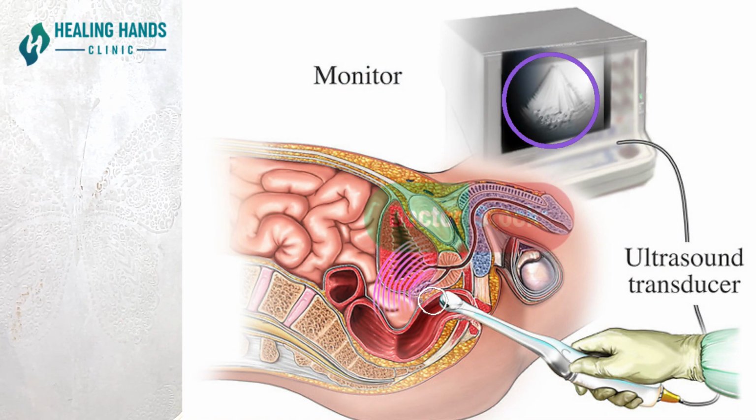This gives us an analysis or an overview of the anatomy of the perianal region, with which we can visualize the internal anal sphincter, the external anal sphincter, and the puborectalis, the various parts of the levator ani muscle. And associated with this, if the patient has any pathology like a perianal fistula or maybe a perianal abscess.